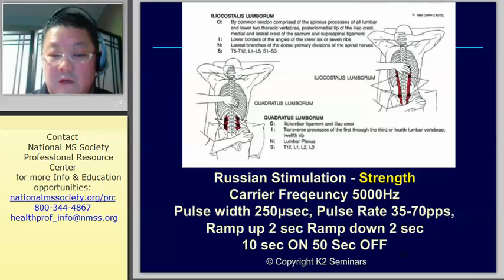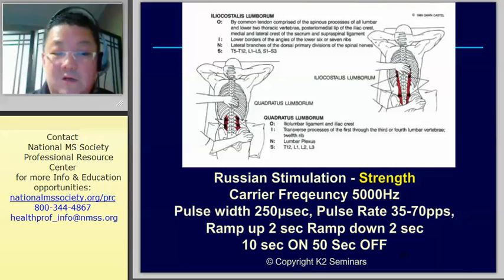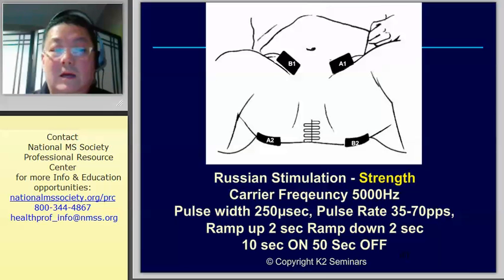All right, so did the parameters change? No. If I'm dealing with power in a different muscle group, it's the same parameters no matter how you cut it. So it makes it simpler. Here it is in the iliocostalis. Something else to consider is the back extensors. Here's the strength mode again. I put it in again because here's the parameter. It did not change, guys. So it's the same set. Don't get caught up with the parameters. Get caught up with assessing the patient appropriately, picking the right muscle to strengthen, and then you'll be able to do it just as well.